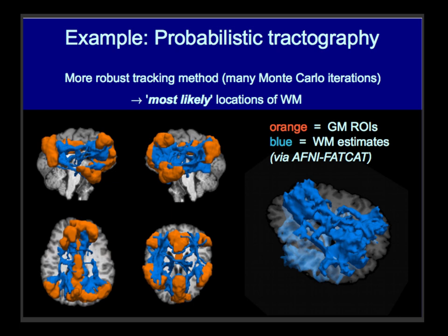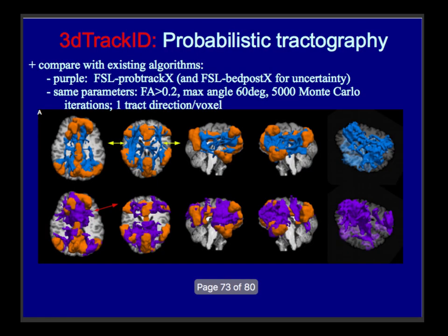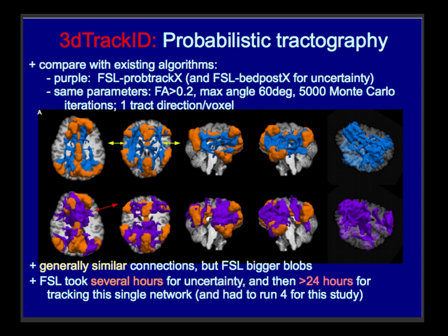So our data is noisy, it's distorted, we know we have noise in there. We try to take that into account by doing what are called Monte Carlo simulations, which just means I do lots of random perturbations over and over and over again and try to get a sense of which tracks I believe. Hopefully my noise isn't affecting me as much. It's a lot more robust, and then potentially snarky slides showing how it's better than other software, but you guys know that already, so that's fine.